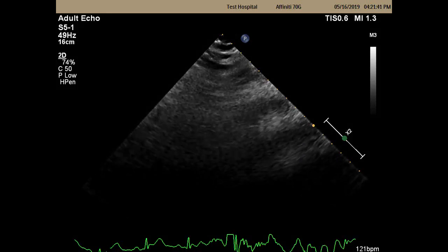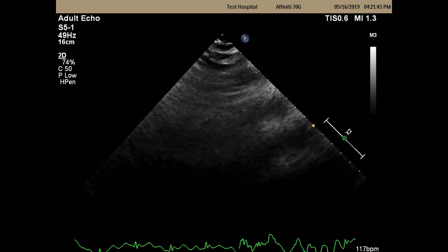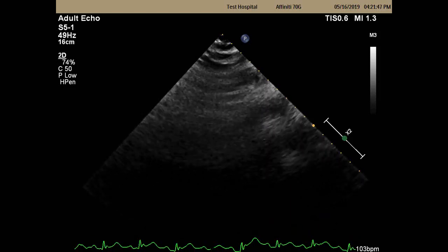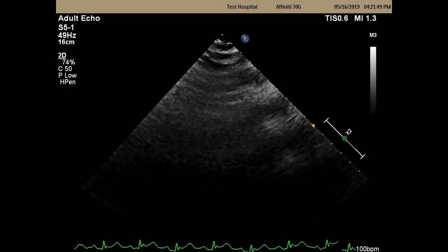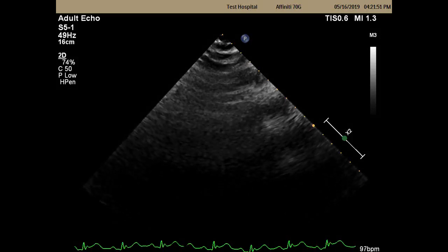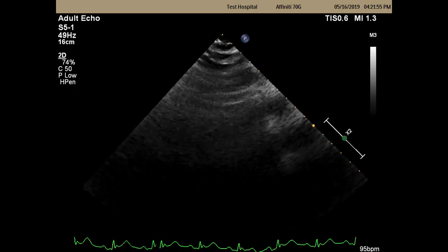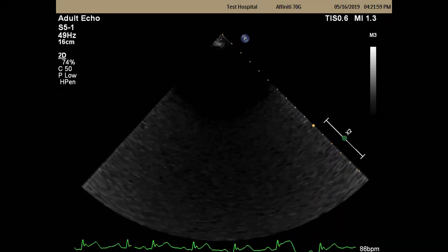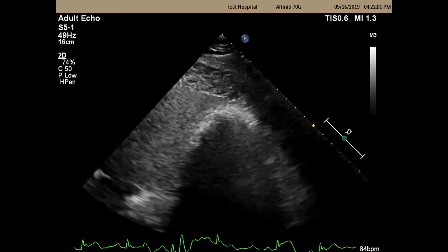So the apical imaging is where all this is at. Let's say you go back home, you have a machine, you're like, what? That stinks. I don't even have strain on the machine, so what's the point? Eventually you will, and the best way to make use of it is become really good at imaging all three of the apical imaging windows. So I'm going to talk a little bit about tips and tricks you can do to get better at imaging these sometimes difficult windows.